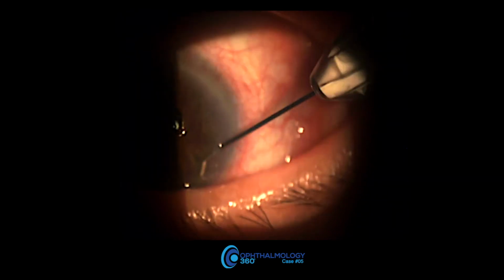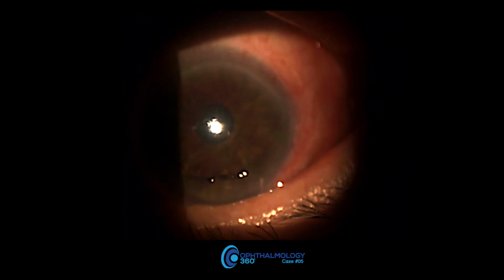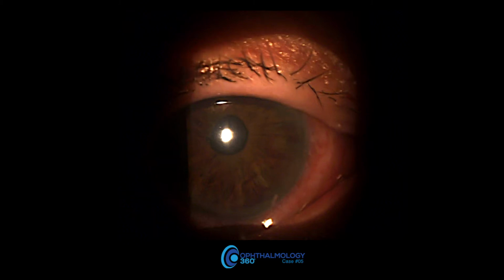And you see I can go in there, but even at an acute angle, sometimes the implant will adhere a little bit, but you can see that it gives you a better opportunity to have the implant release quickly and fall inferiorly.